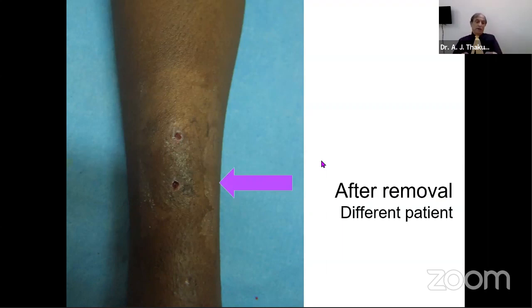So in my hand, this gauze piece method of packing the space between the clamp and the skin very tightly with PEX works very well. That is eliminating the movement between skin and the pin, and that works fine. If one can find some different method of stopping that movement, it would be very useful.